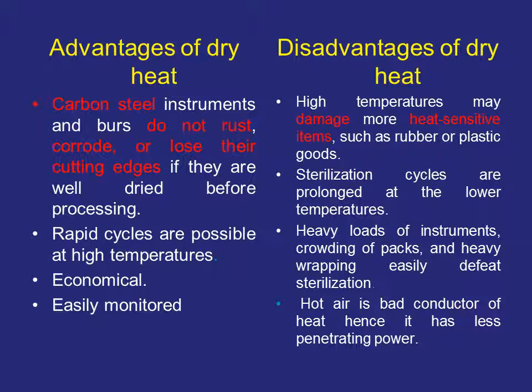Disadvantage of dry heat is that heat-sensitive instruments such as rubber or plastic goods may be damaged by the high temperature. Sterilization cycles are prolonged at a lower temperature.